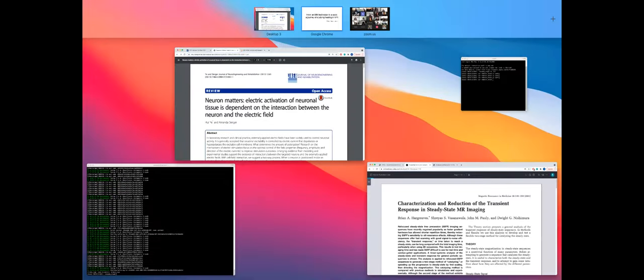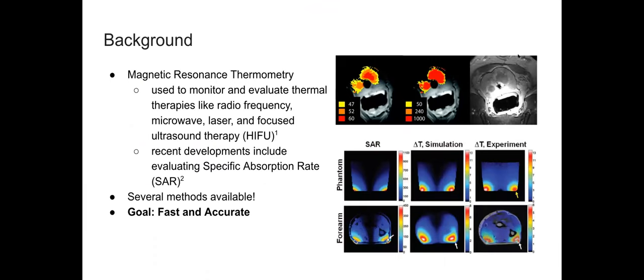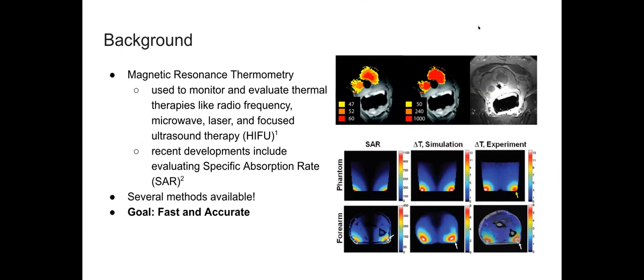We'll be presenting on MR thermometry. So our talk is, there we go, From an MRI Technician to a Cook: A Journey of Studying Heating in MRI. So some background on MR thermometry. It's used for in vivo temperature monitoring during thermal ablation therapy, such as focused ultrasound. It's non-invasive, so we prefer not to stick a temperature sensor into the patient, right?